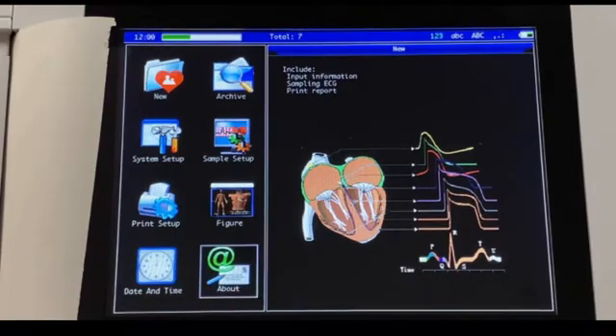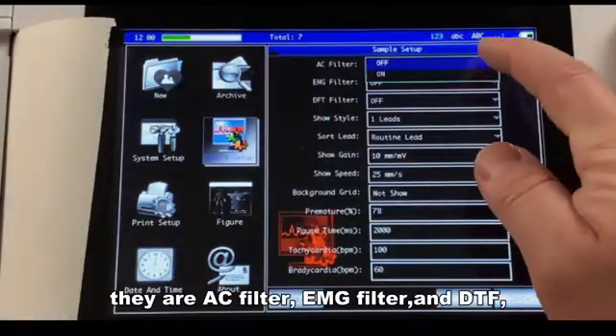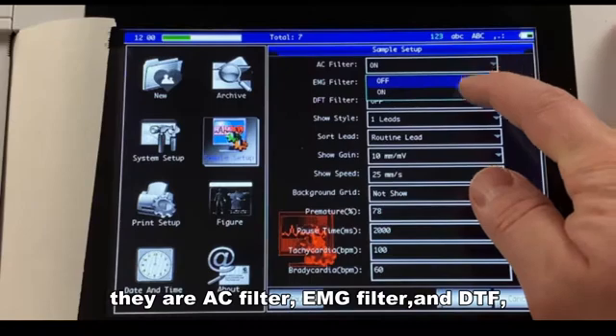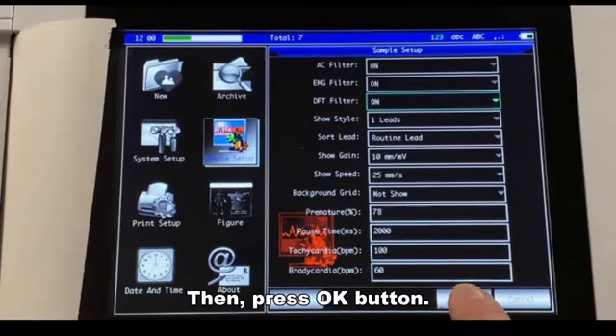Before a new recording, please enable the filters in the Sample Setup. They are AC filter, EMG filter, and DFT. Press OK.